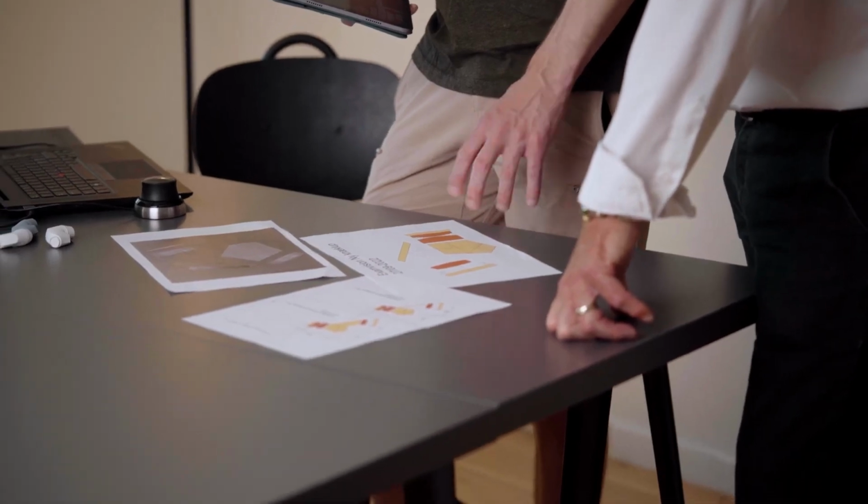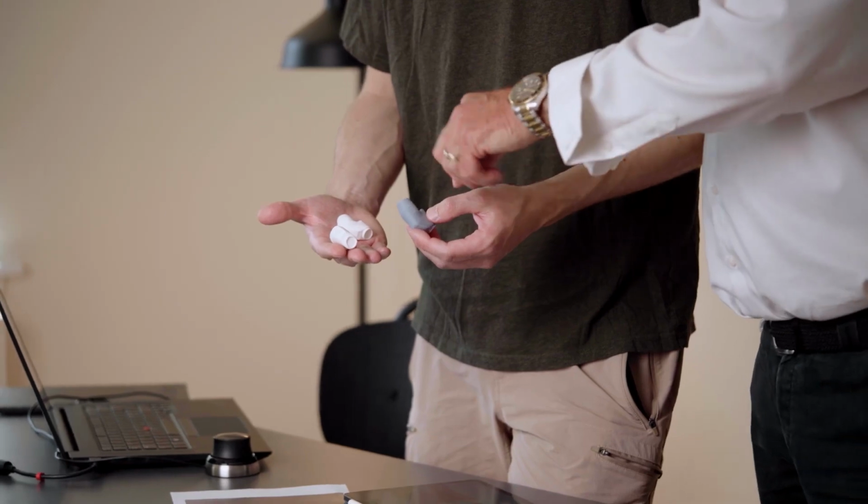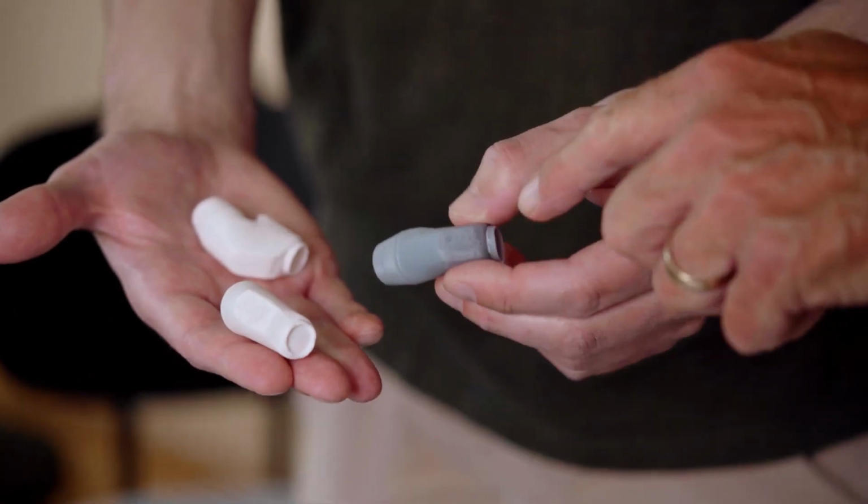Kim had already developed a first version of the optical system together with Copenhagen Optical. So I just got these crude parts and I was asked, can you make a design that makes this possible in the real world? But nobody had any idea how these parts would go together. How can you even make a shape that can be assembled around the parts? Lasse is our product designer, a very smart and clever guy, and he has been designing a lot of things for us. The form is very natural for what is inside the loop, like creating an organic or aerodynamic flow that connects these otherwise very blocky parts.